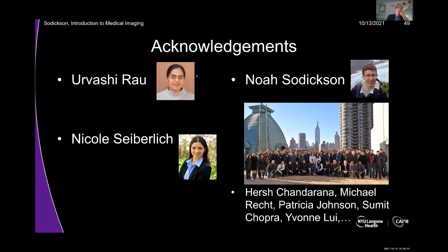Sure. And this is a longer discussion that I'm happy to carry on beyond this as well. One of the things we can do, because we control our encoding in MRI, is work a forward problem into our data consistency term. I'm going to use MRI as an example, although this kind of thing can work for other modalities as well. We know we acquired data with these k-space values, and now let's compare our working image against something that has those k-space values. So we can work in knowledge of the experimental encoding, which means we're never going to choose an image that is not inherently consistent with the acquired data, the data we know we acquired in this pattern.